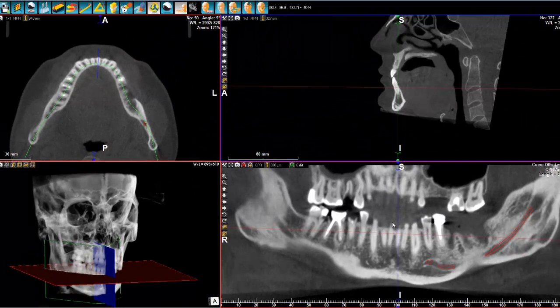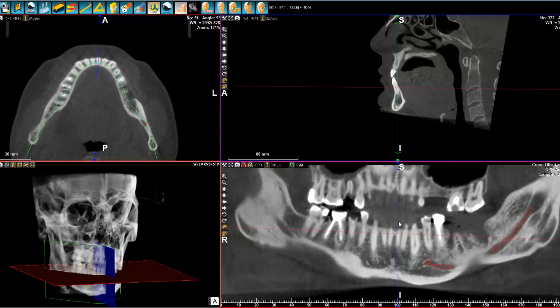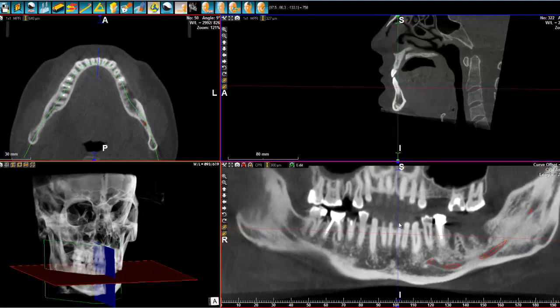With the mouse wheel, if I apply the mouse wheel, you can see that the image is changing. If you look just at the curve right now, and I come here and move the mouse wheel, as you can see, the curve will go inwards, and on the other side go outwards. So that means that you have here a dynamic image that you can really move. It's not a dumb panoramic where you have simply your image.